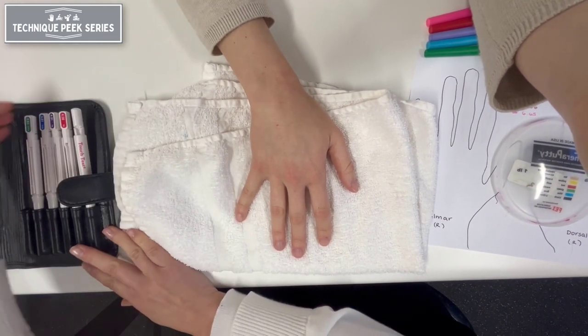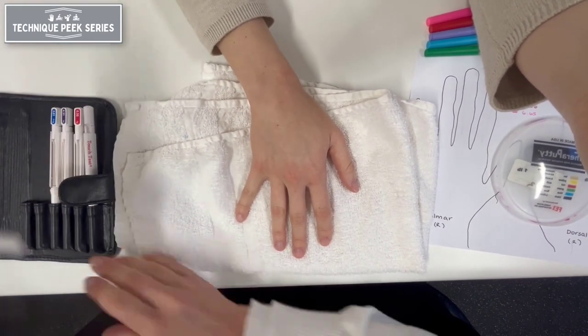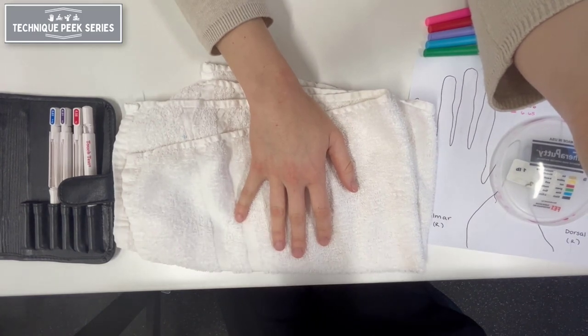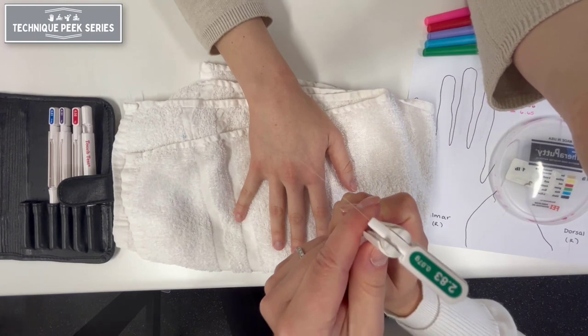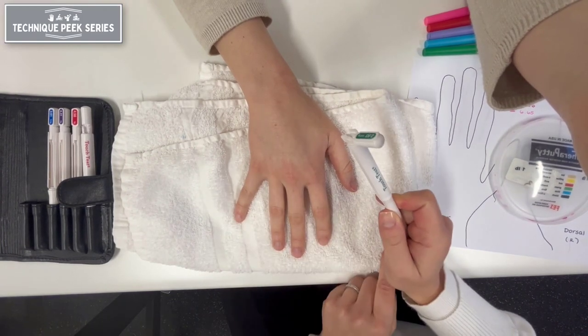Explain the testing procedure to the patient and instruct the patient to respond when the stimulus is felt by saying 'touch' or 'yes.' Nonverbal patients may tap the table lightly when a stimulus is felt.